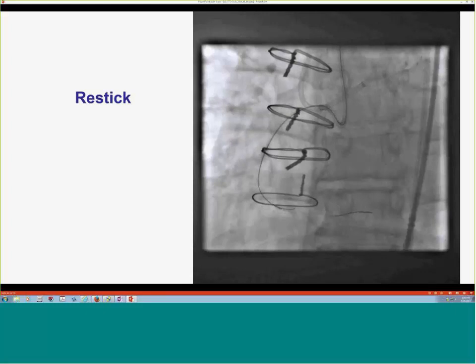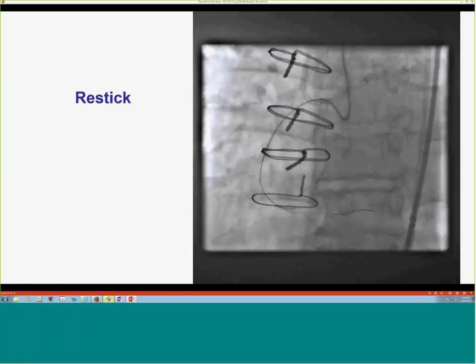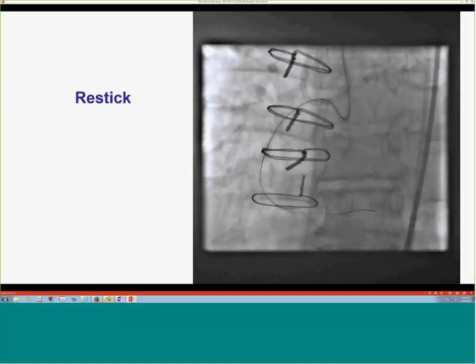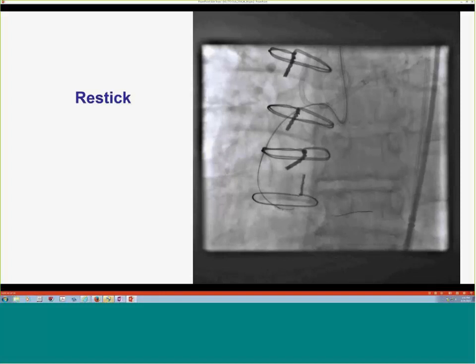Okay. So what they say, and I must say, I think they have a point, is that if you can, it is best to just try to do it without injecting, just by dual injection, contralateral injection, or by using IVUS. The other way is to put a soft wire, your workhorse wire, Sion Soft or BMW, whatever, and see if it goes easily into branches, which gives you an indication you're probably in the true lumen. Sure.